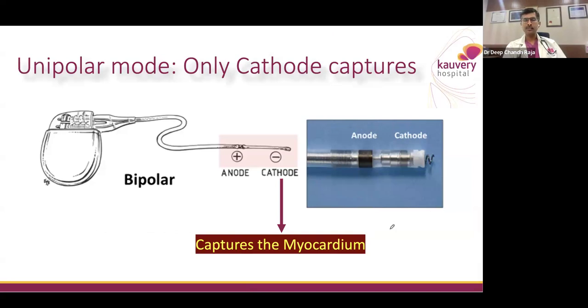The right ventricular endocardium is like a screen there, which you will be able to peel off from the myocardium, mid-myocardium. And if the lead gets caught in the endocardium, then it just moves round there. You will not really get past this interventricular septum. And hence, the fastness of the movements there, trying to pierce the lead fast into the interventricular septum, helps us get past the endocardium quickly into the mid-myocardium. And from there on, the rotations could be slower. At that point, it's important to have the connections.